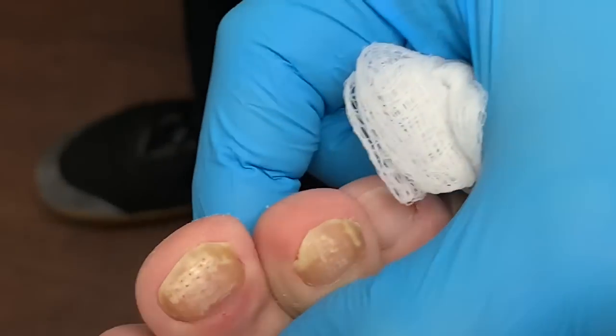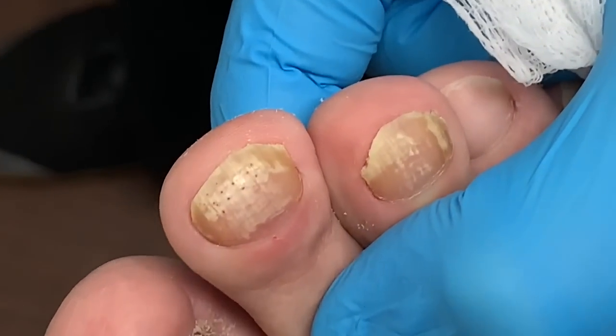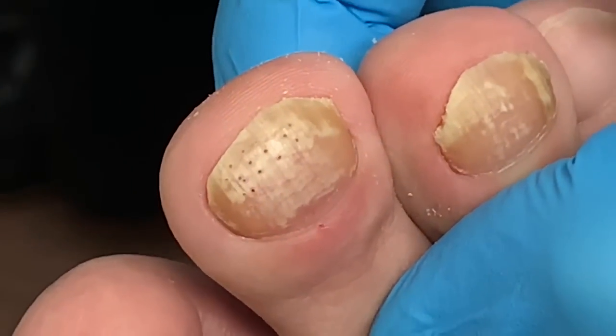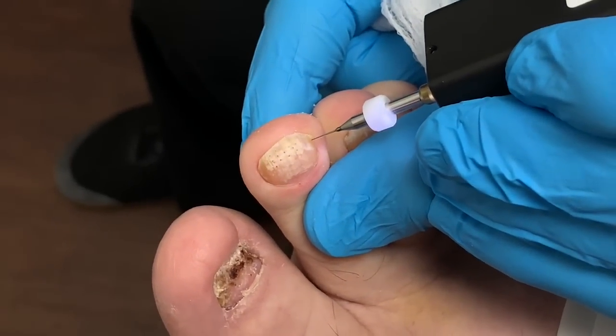Do we have a good visual there? Get closer, give it a zoom — look at all those little holes. That's the purpose. We can maybe do a couple more right here, carefully.